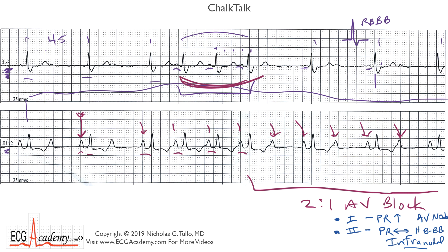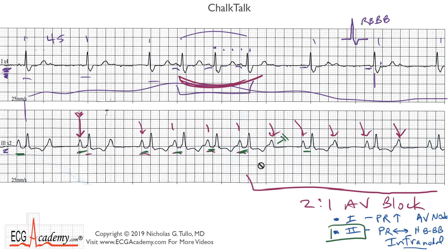Let's take a closer look at the PR intervals. When we look at the second strip where the P waves are much clearer, it appears that the PR intervals do not change — they seem quite fixed. This run of four QRS complexes in a row has a stable PR interval, then you drop a beat, and then the PR interval following the pause looks the same as the PR interval preceding the pause. That goes along with type two second-degree AV block.